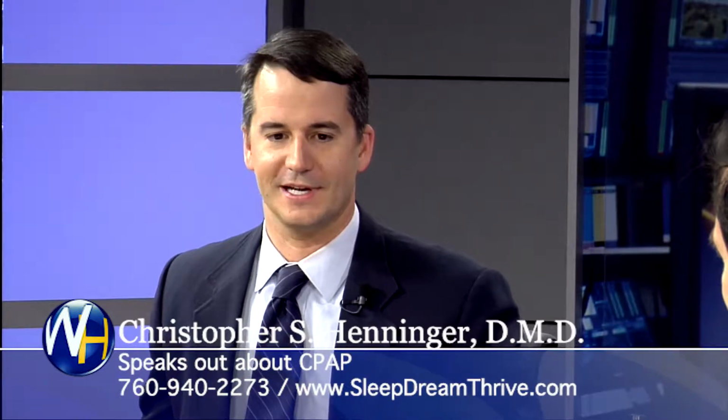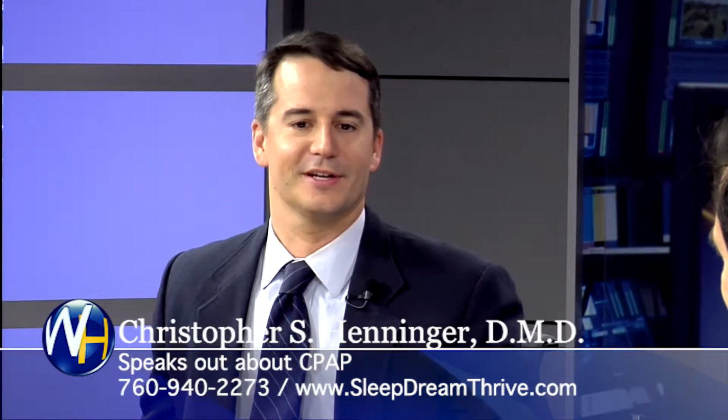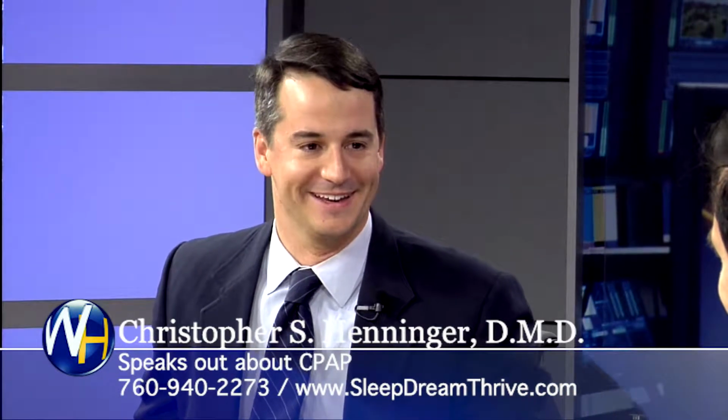And I said, well, why don't you try a dental device, or this oral appliance? And he's like, he never gave me that option. And I said, yeah, it's simple. It's like a retainer. You wear it at night, it advances your lower jaw, and it reduces or eliminates, in some patients, the snoring. And we just recently got him into wearing it. He's been in it about 2 months now. He's like, Dr. Henninger, it's the darndest thing. My wife lets me sleep in the room again.